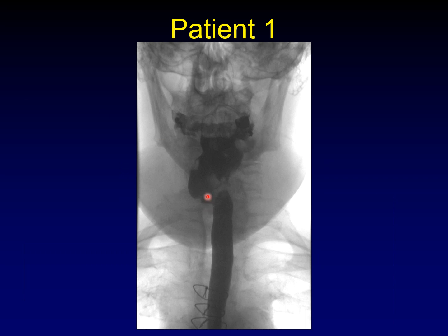You can see that there is asymmetric utilization of the piriform sinuses during this swallow. There's a lot more contrast going down the right piriform sinus than the left.